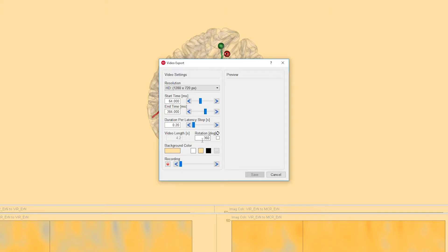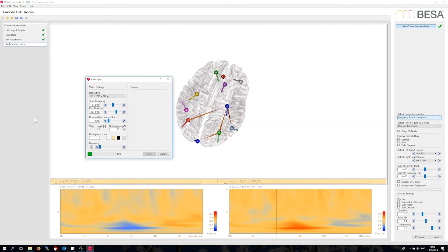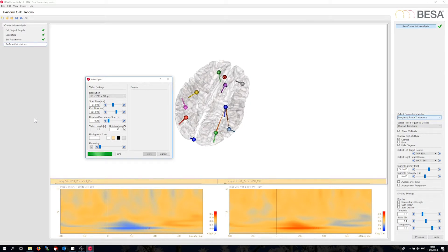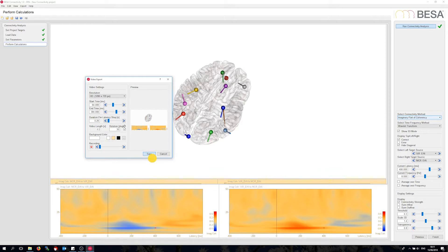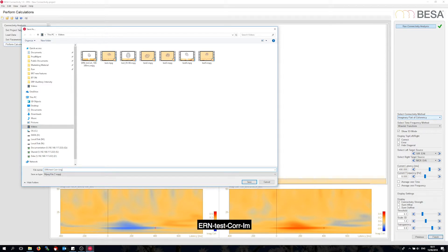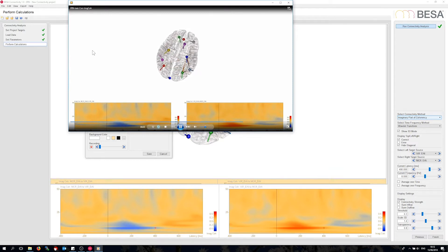Let's add a rotation so we can see the third dimension better in the video — 30 degrees, going to and from. Once it is complete, I can save it to file. Let's have a quick look at it with the Windows video player. We can see how the latency runs through the time points, and how the network adjusts.